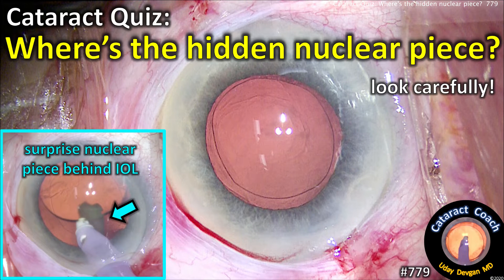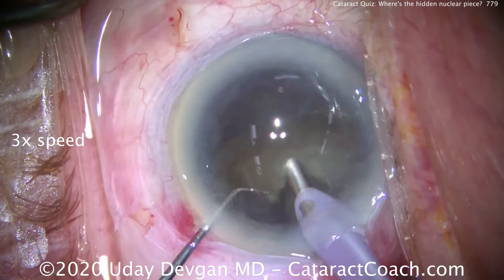CataractCoach.com cataract quiz: where's the hidden nuclear piece? Look carefully — there's going to be a very big surprise nuclear piece coming up.